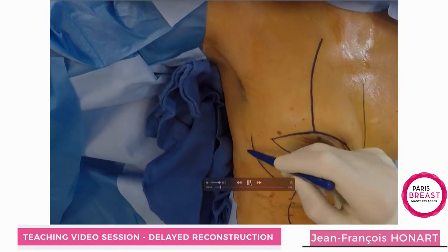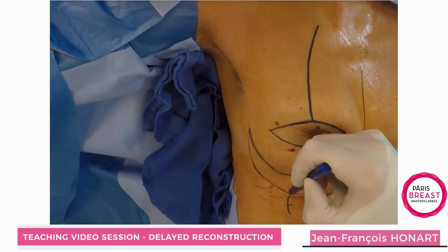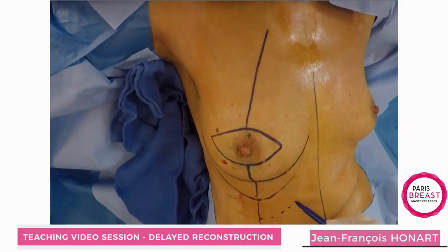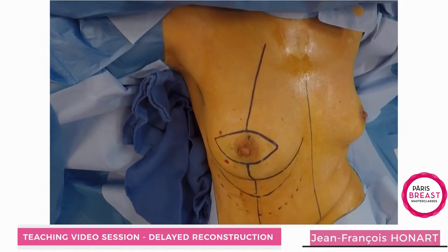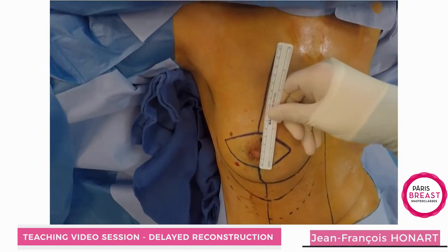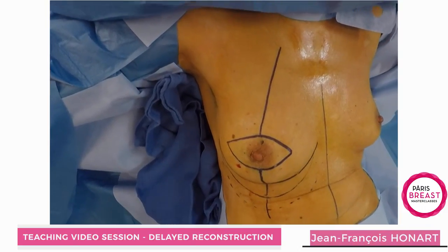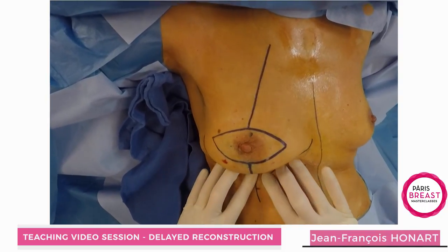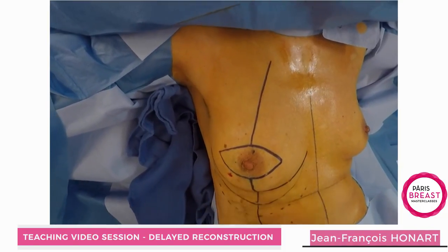We will use an expander because this patient will have post-mastectomy radiotherapy. For the markings, you take the distance of the skin that you are going to remove, report this distance on the abdominal area, and draw the future inframammary fold. The second line corresponds to the undermining of the abdominal skin. All the skin will go up and we will recreate the shape of the breast.